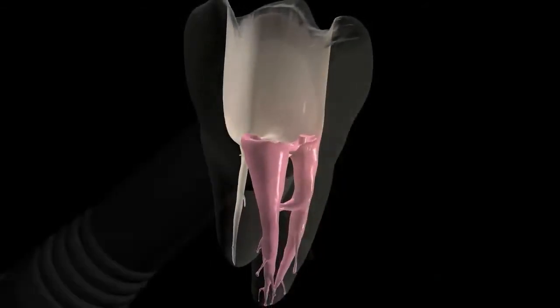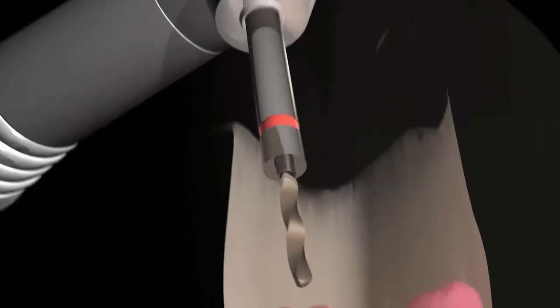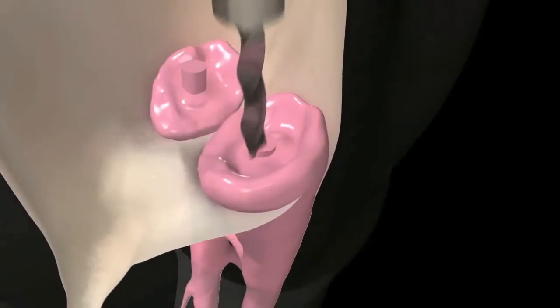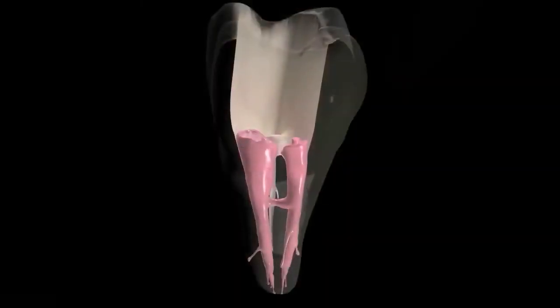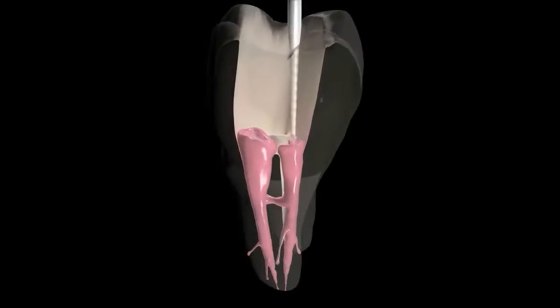Gutta-core obturators remove easily like gutta-percha because they are gutta-percha through and through. You'll see the familiar shredding characteristic, whether you're creating post-space or retreating.